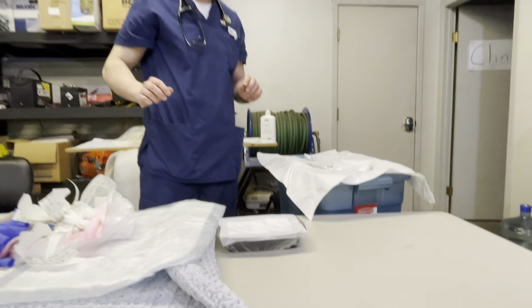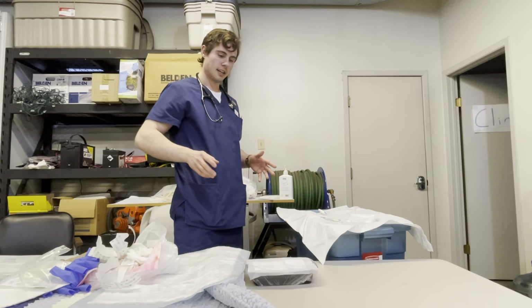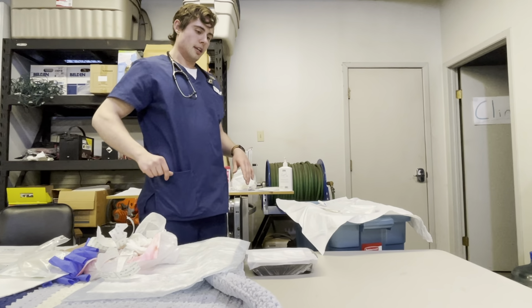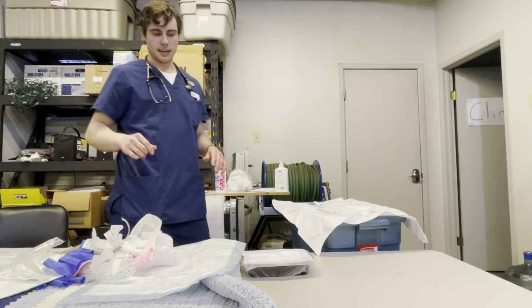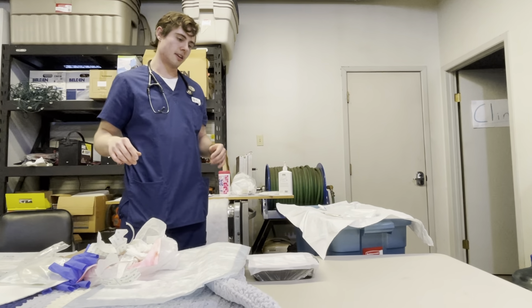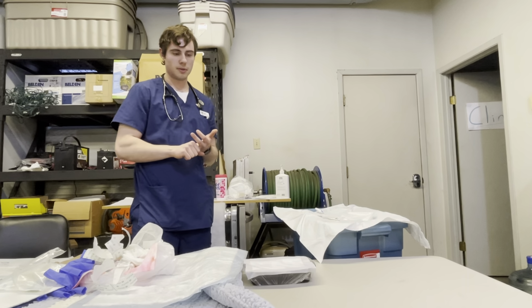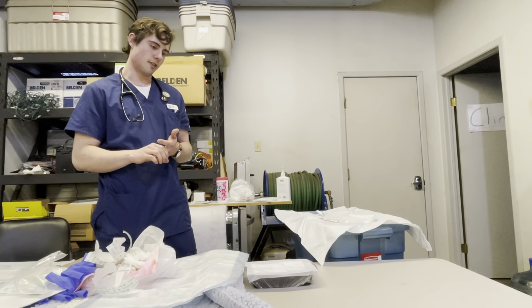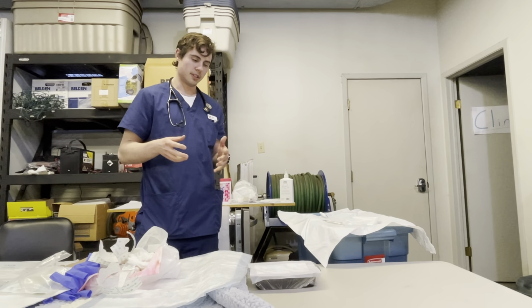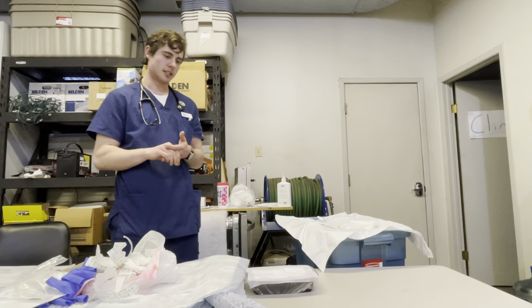After that, I'm going to ask the patient if they're doing okay, they have no pain, if they need anything else, they're okay. I'm going to make sure to lower the bed to the lowest position. I'm going to clean up all the bedside supplies. I'm going to do my exit safety check and everything that entails. I'm going to then document, when I leave the room, on all the specifics about the wound care, what we noticed about the wound, the specific dressings that we use, the 4x4s and the Mefix, the time and how the patient handled the procedure. I'm going to document that on the IPN, Cardex, and any wound care flow sheet, and that's it.